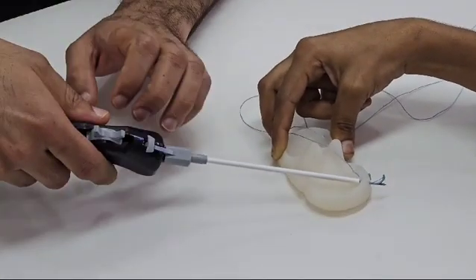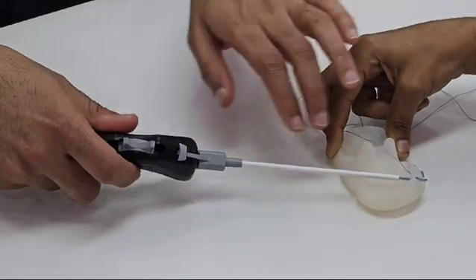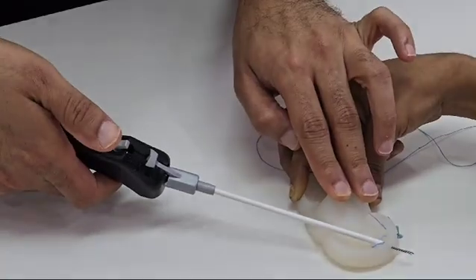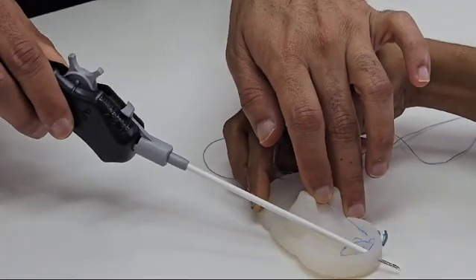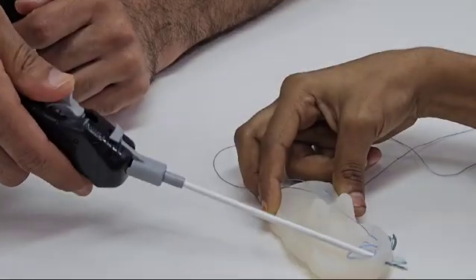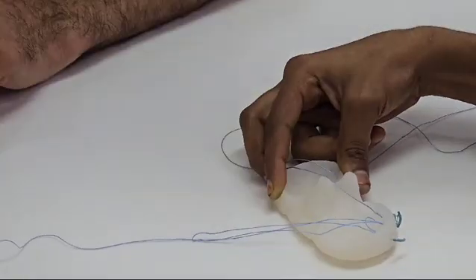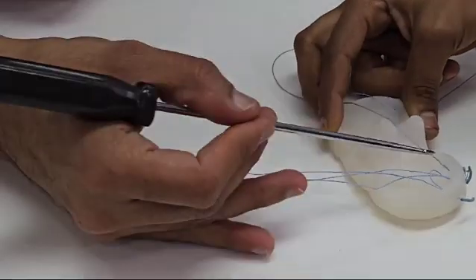This will actually fire the implant and we have to take it back slowly. Now we penetrate the second implant like this, and then we fire it like this and fire it back out. You can see that there are two implants which are sitting on the back, and then there are three loops.